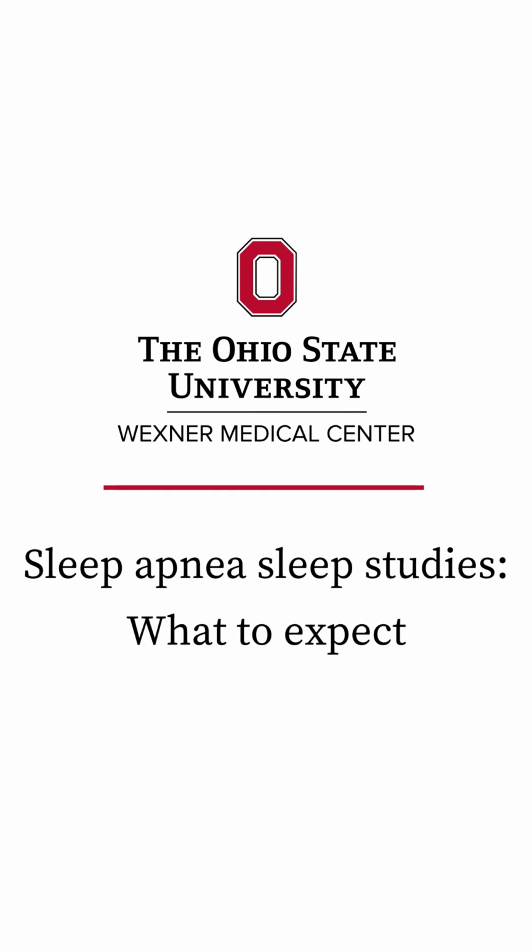We diagnose obstructive sleep apnea with a sleep study. There's two types of sleep studies. One is a home sleep study or a home sleep apnea test. Typically, we monitor breathing with that, but not always sleep. So we can monitor whether or not somebody is having apneas.